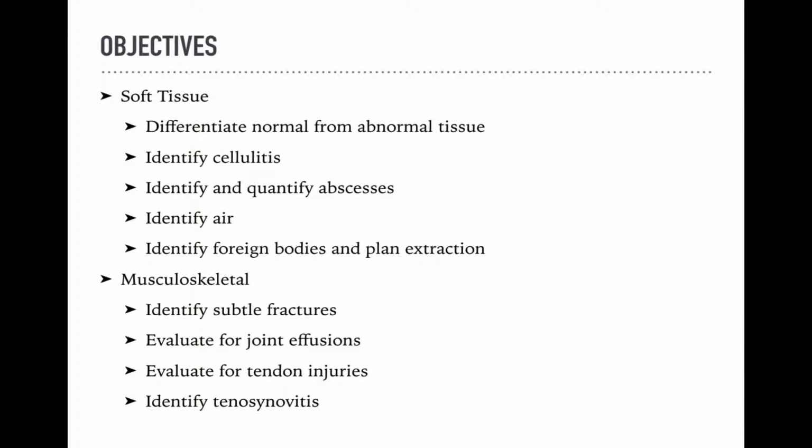On the MSK side, we'll identify some subtle fractures and some not so subtle fractures. Teach you how to evaluate for joint effusions and why you should do that. And also how to evaluate for tendon injuries and tenosynovitis.